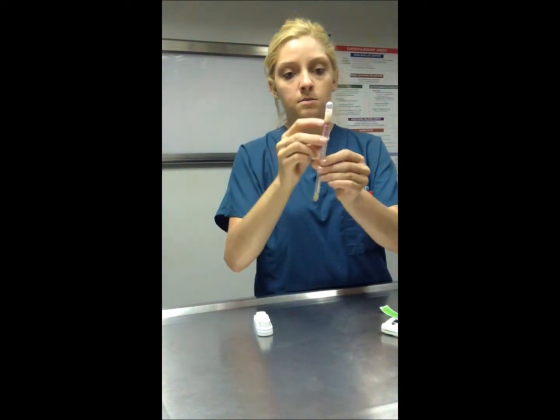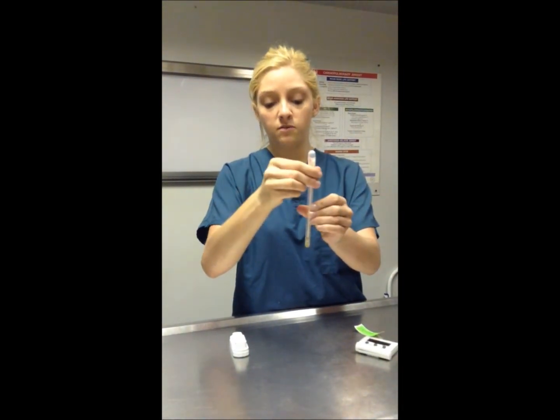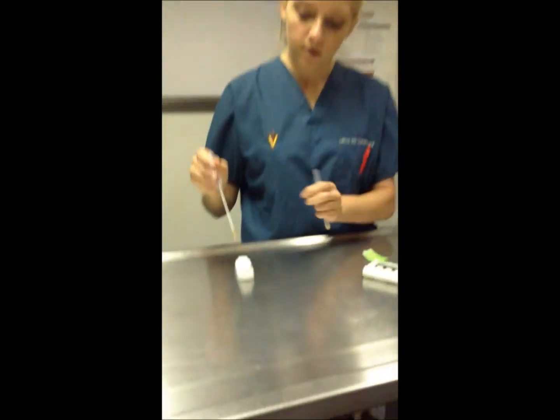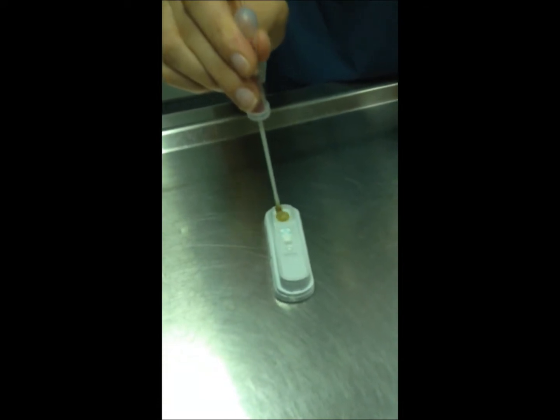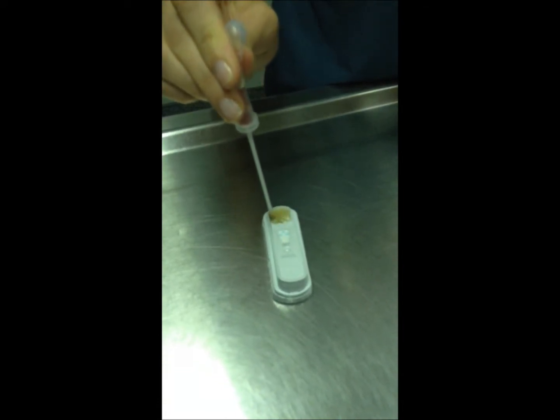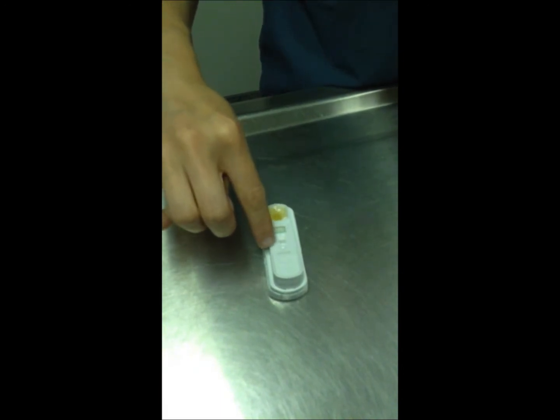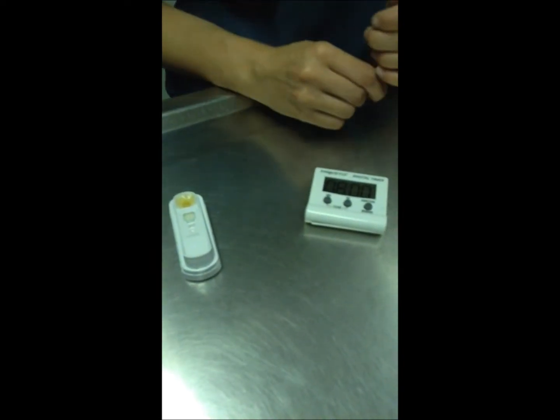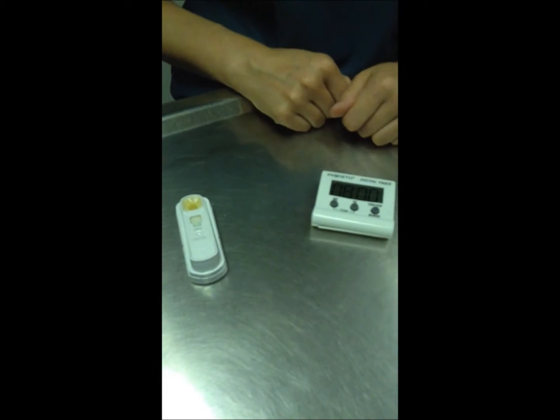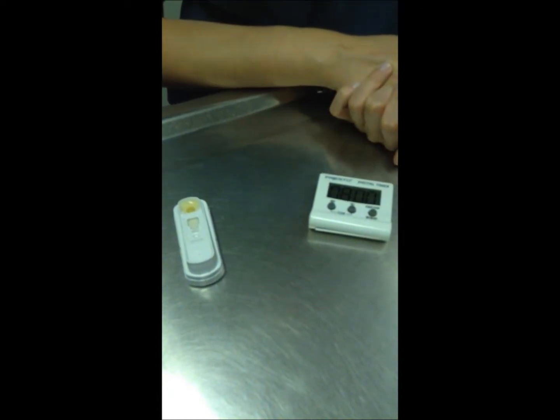And then it basically sucks all the solution back up into here, where it's now mixed with the fecal material. And you're going to completely empty this little area into the snap test. Okay, and then you allow it to run down, and once it reaches this little dot, you're gonna snap it down and we're gonna start the timer. You wanna make sure you put a lot of force on it so you get it to snap all the way down the first time.